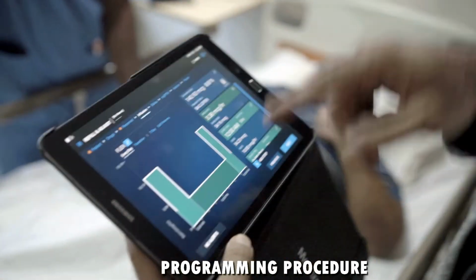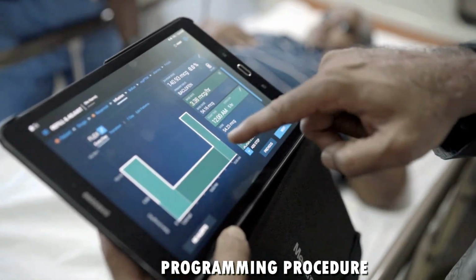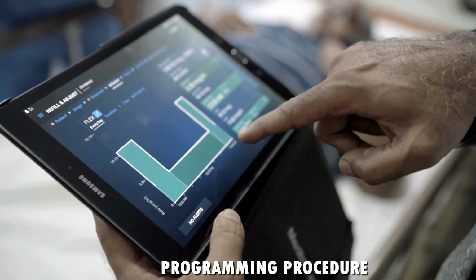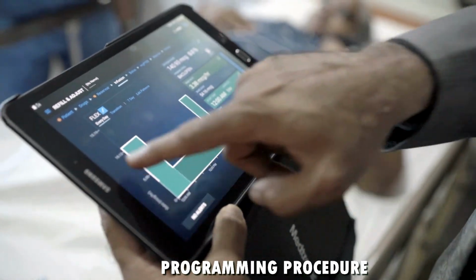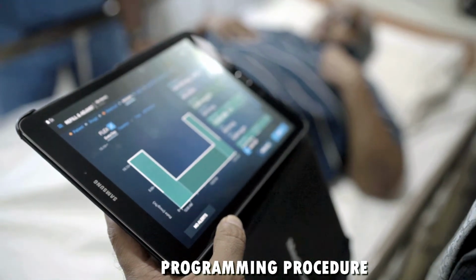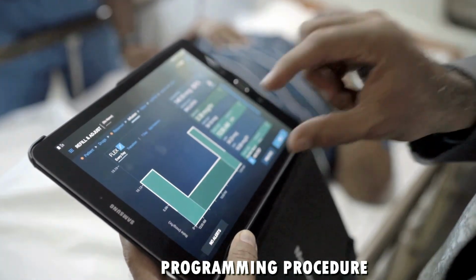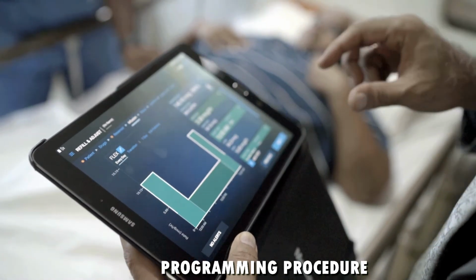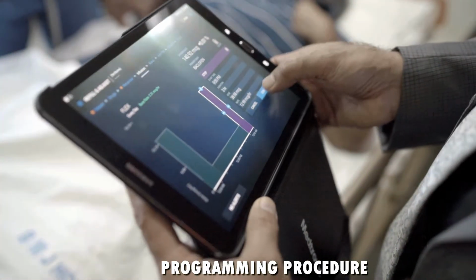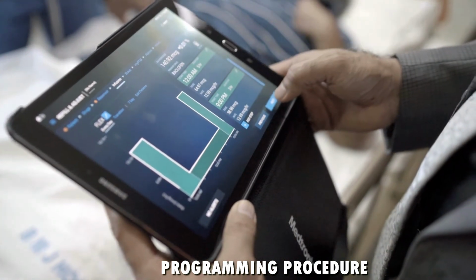If you see here, she's got a baseline dose going here, and she's got two bumps here. One bump is for the early morning from 12 o'clock to 5 o'clock in the morning. The other bump is from 9 p.m. to midnight. She needs this extra dose because she's getting tightness in the night when she's sleeping, some pain, and difficulty turning to the sides. So we are trying to program it precisely at that time, so that the discomfort goes away. Done, confirm. Both have become the same height. So I've increased the dose now.